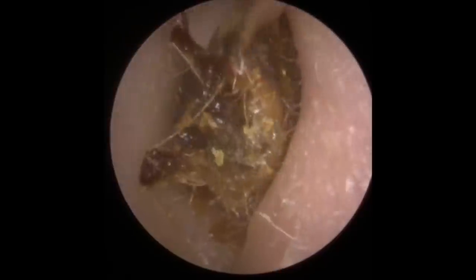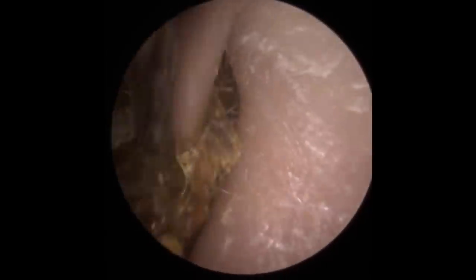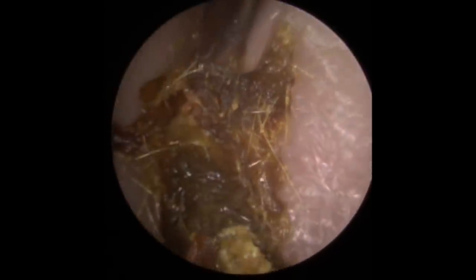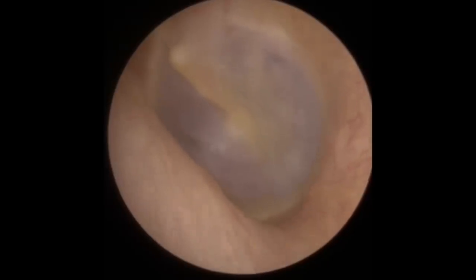So this is our second patient. You can see much harder earwax - can you see the difference? As soon as you get a grip on this harder wax, you start to take it away in larger chunks. So you can see this is drier - getting a grip on it with the Zolna tube and then maneuvering this out of the ear canal. A little bit of dry skin looks a bit attached to the end of this, which is just holding it and stopping it from coming out. So this is the reason this person's wax has built up - it's quite old wax there as well. There we are, got a good grip on it. You can see how much quicker that was to remove - so much easier to come away.